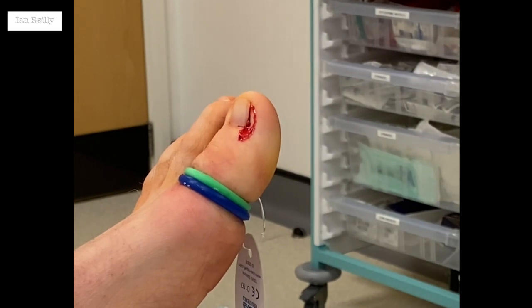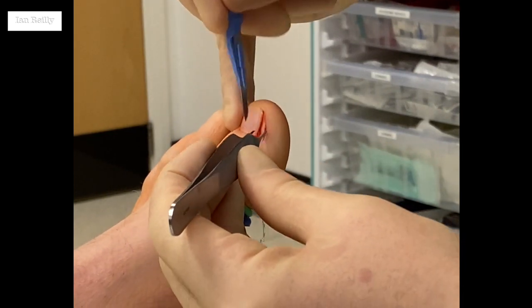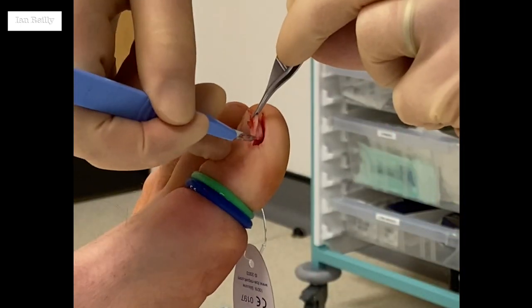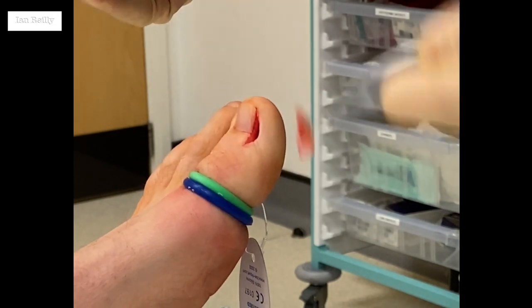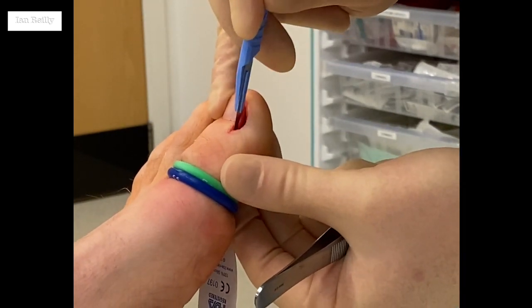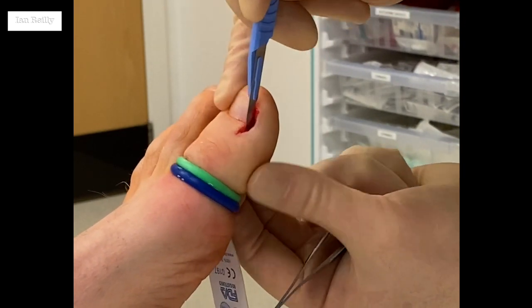Now if you're in any doubt as to the type of tissue that we're taking out, we would histo those. You don't need to for Andrew, because there are as yet undiscovered tribes in South America that know this is nail. But if you're taking out a little fibro keratoma or any little tissue like that, you can take that out. I'll do a close-up shot of that in a sec. But there it is — there's the nail root. I'm just going to pop that to one side and we'll just have a little scoop in there, down to the nail, scratching down to the bone.